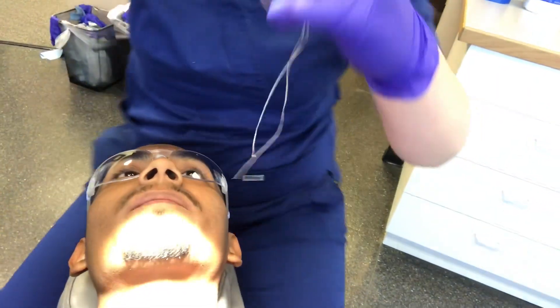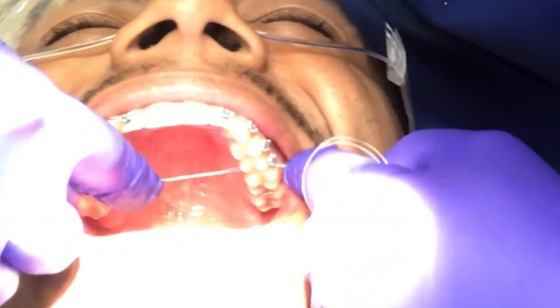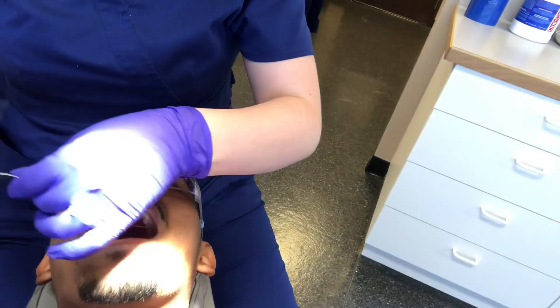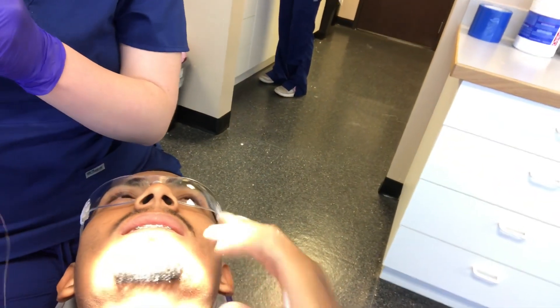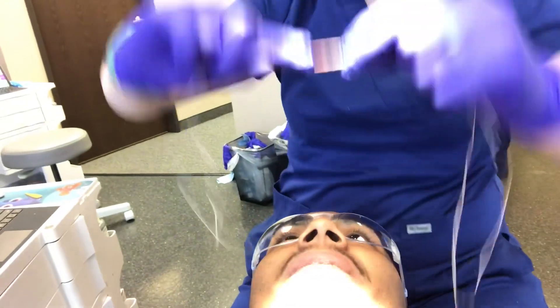All right, three more. Just floss — no pressure yet, and it has plenty of space so we got this. Here's that pressure. You did awesome. A little wiggle here. Done. Two more. Now, if these come out two days before your appointment with us next week, don't worry about it. Getting these out does not hurt at all — getting them in sucks. But next week when we take them out, it won't hurt at all. If one falls out more than two days before your appointment, you've got to call us so we can put it back. In order to keep these in, stay away from gum, stay away from anything sticky or chewy that can pull it out. You don't want to do this again, right? Exactly.